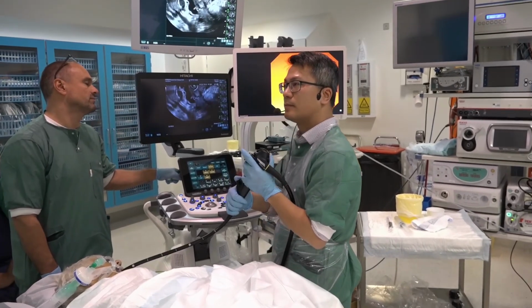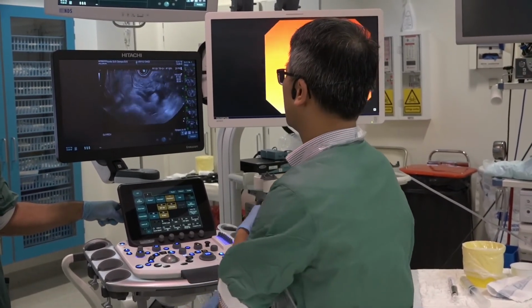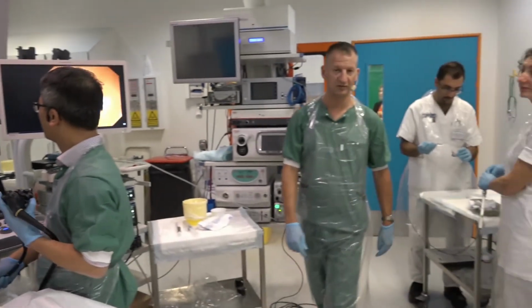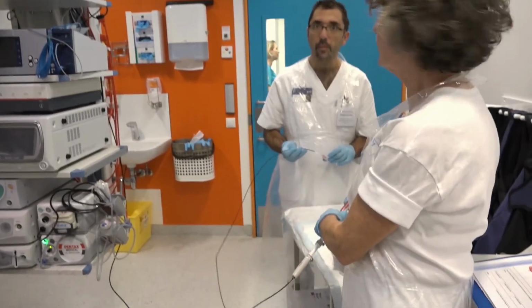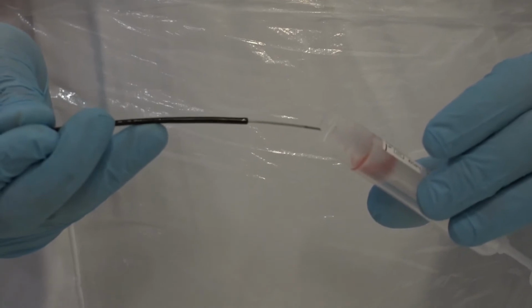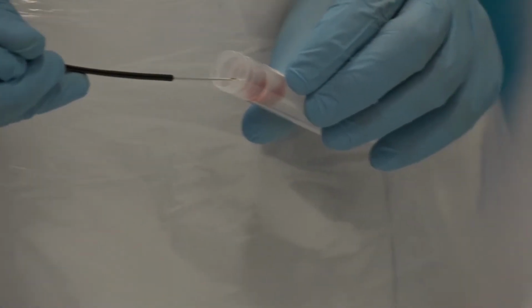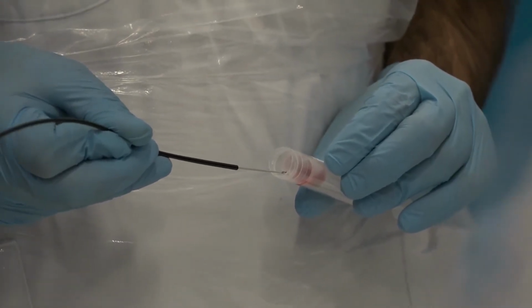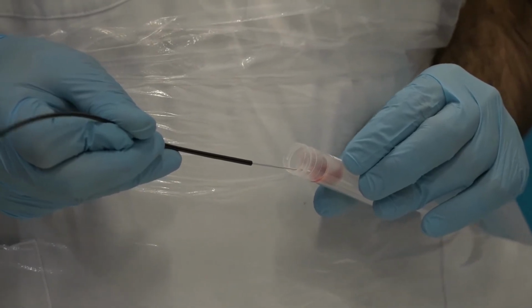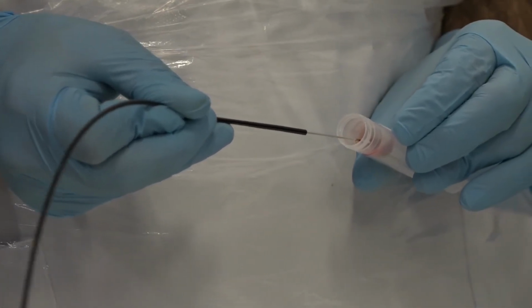So while they're going over a lecture, we can do the ERCP. Can we see the specimen just before going away? Yeah, if you can show the specimen, I don't know if you can move the camera towards the specimen. So we are putting the specimen here in liquid. So this is the Cook core needle. So we are introducing the stylet back into the needle.